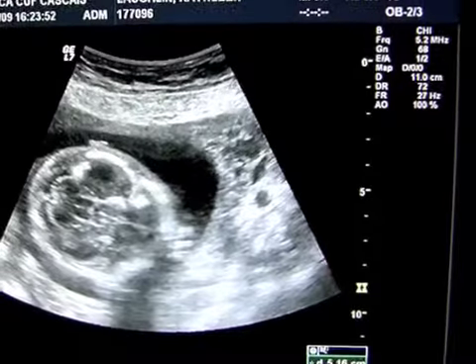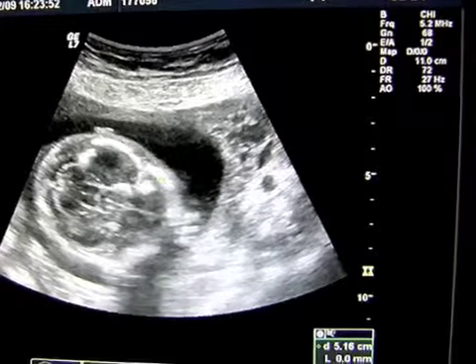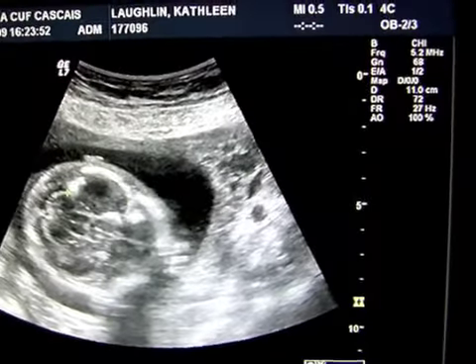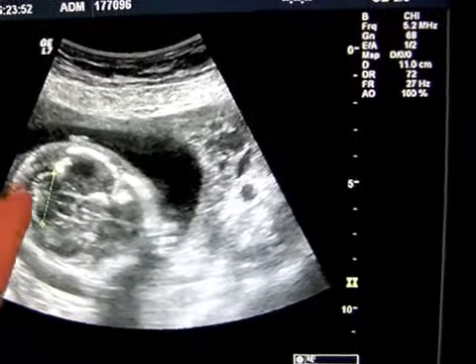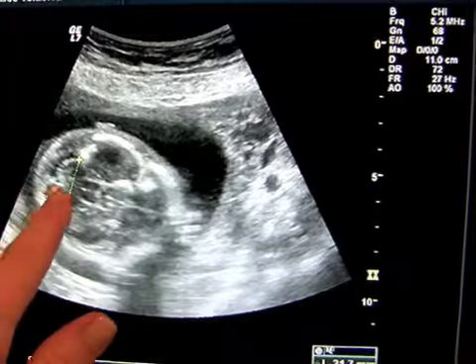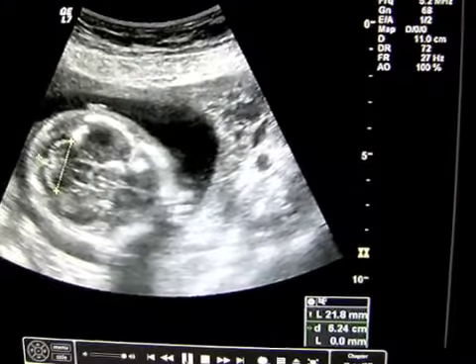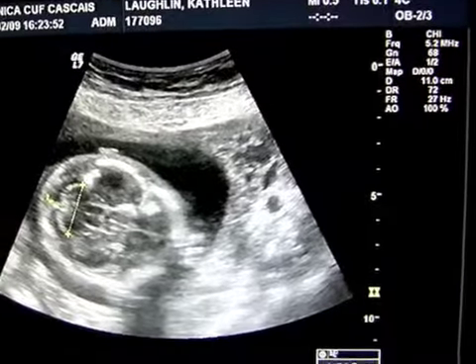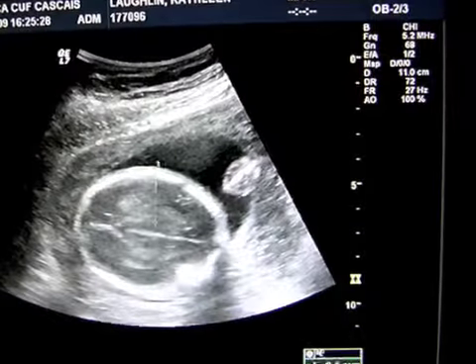Okay. I think I've got this working. At this point, we are looking inside her brain, and he was doing some measurements of key elements inside her brain to make sure that she's at the right developmental stage that we thought. You can see his pointer moving over here, and he's measuring the cerebellum of her brain, and everything was great there. And then he's going to measure this little bit here, and that helped us to determine more accurately or just make sure she's at the growth point they think she should be given my due date of June 21st. So you can see, throughout we were watching measurements come up here of what he thought they should be. Everything looked great.